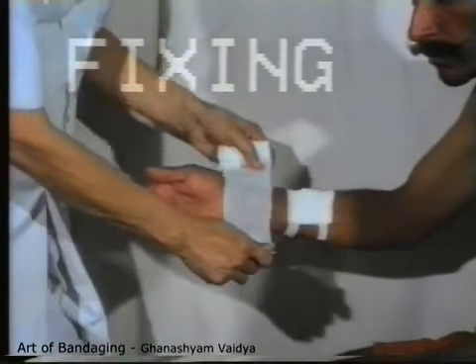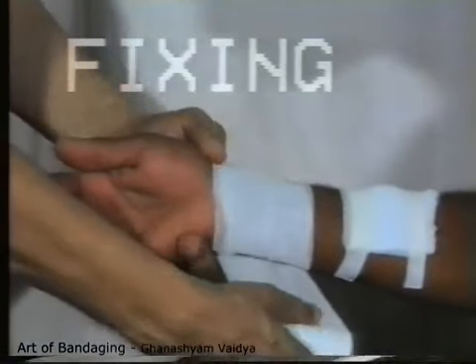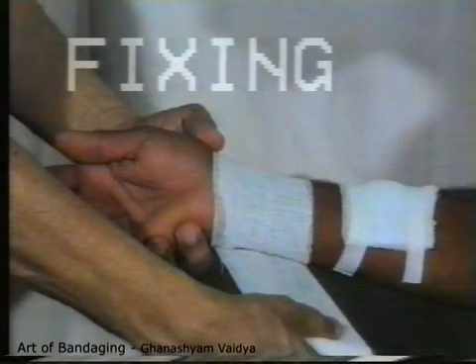The starting point is just below the dressing, avoiding the joints. Roll the bandage 2 times to fix it there. If 2 complete turns are not taken, then the bandage will slip when it is pulled tight. That is why it must be fixed by taking 2 simple turns. The bandage is always rolled from below upwards and from within outwards.